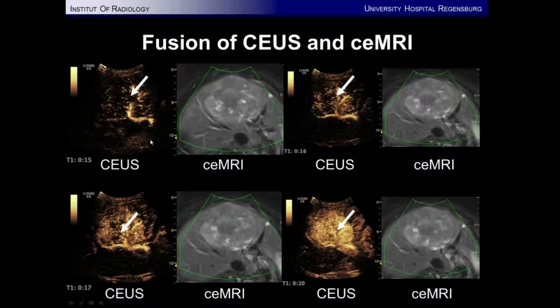Only using contrast-enhanced ultrasound do you get information about the early hypervascularization and the mean diameter of the tumor lesions in cases of HCC lesions. This is very important because in this case, the MRI decision was that embolization should not happen. But from CEUS, you see the hypervascularization, and we could perform a successful treatment using TACE.